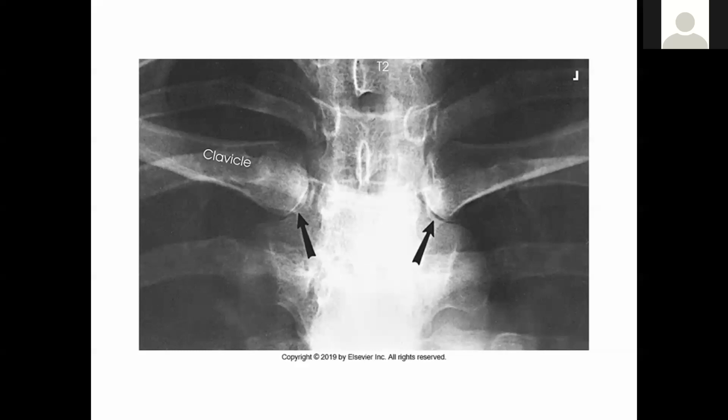They are not going to change their height. So where you're centered in an AP projection, you can now put the joints closer to the bucky and get a better detailed image of those joints. Just turn your patient around. And you can keep them in that position, evaluate your image, and then adjust their rotation for the obliques.